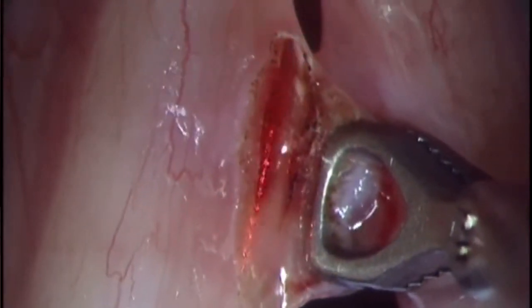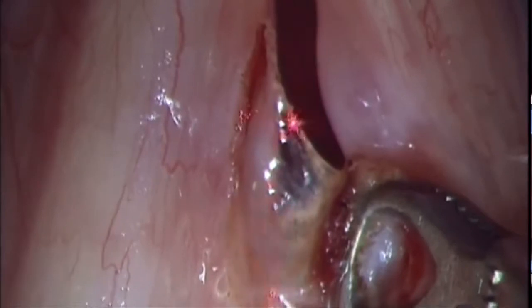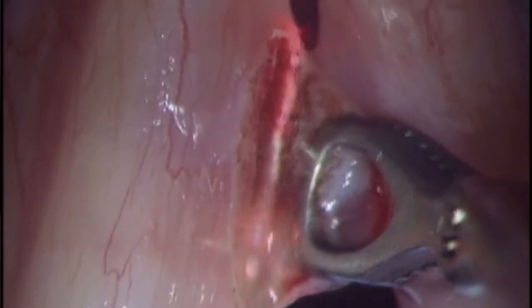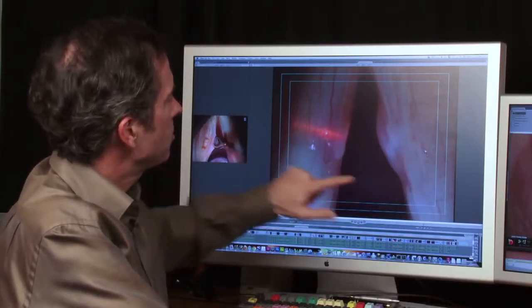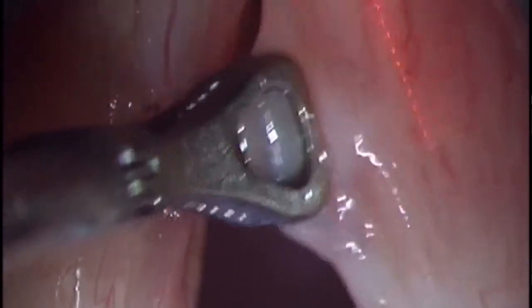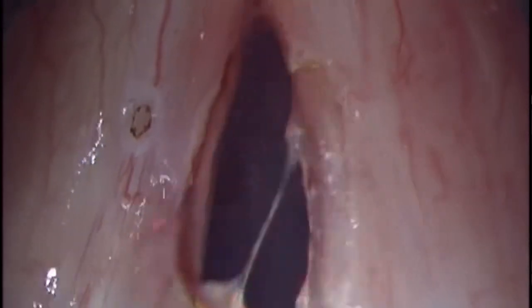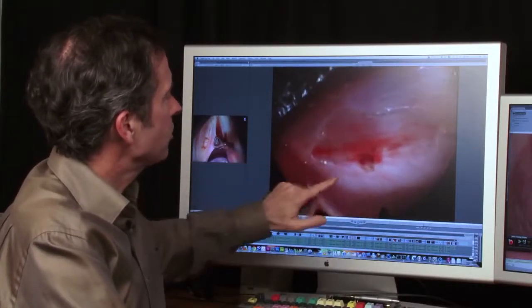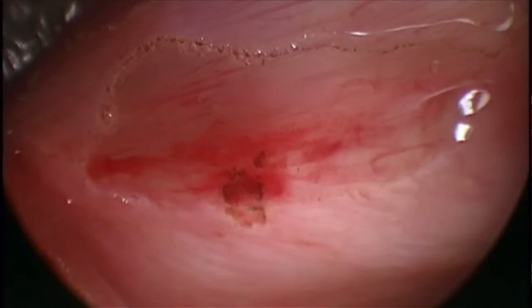That gives me the most room to cut in there. This is a programmable laser called a DECA laser, and it cuts 0.42 millimeters deep with every cut. So I can cut through this polyp very precisely. It seals the blood vessels as I cut. It's a very nice way to take off polyps. And then I will go back, and any dilated blood vessels, I'll put the laser on spot, and I'll try to spot weld the vessel closed so that it's not still feeding the edge of the vocal cord. I end up taking off the other side the same way. Again, grab the polyp, pull it as far away from the vocal cord as possible, set the laser on cut, and cut precisely through the edge of the polyp, leaving the muscle and the lubricating layer intact on both sides. We can see I haven't disturbed most of the blood vessels that are normal.